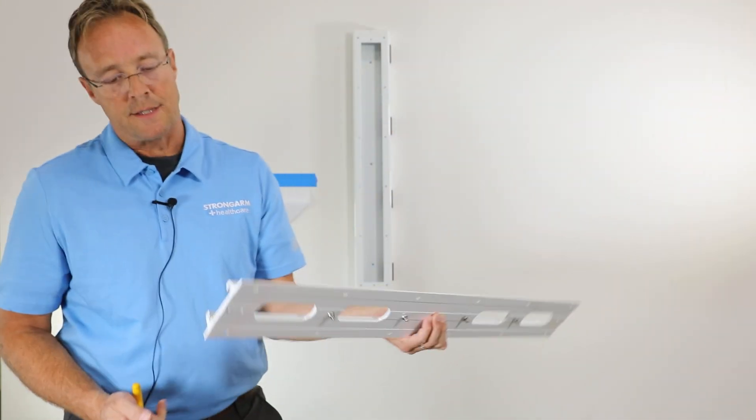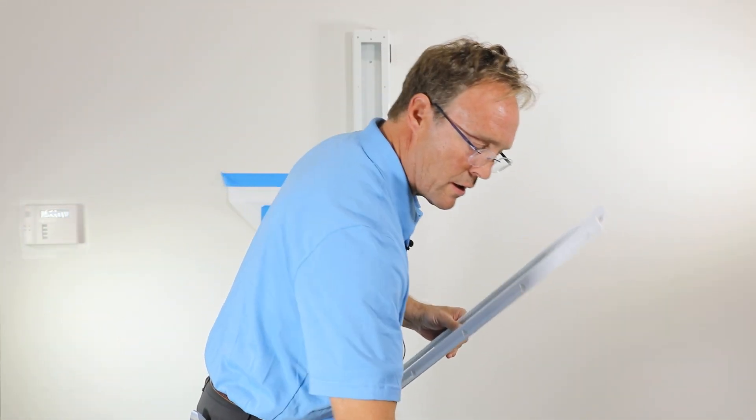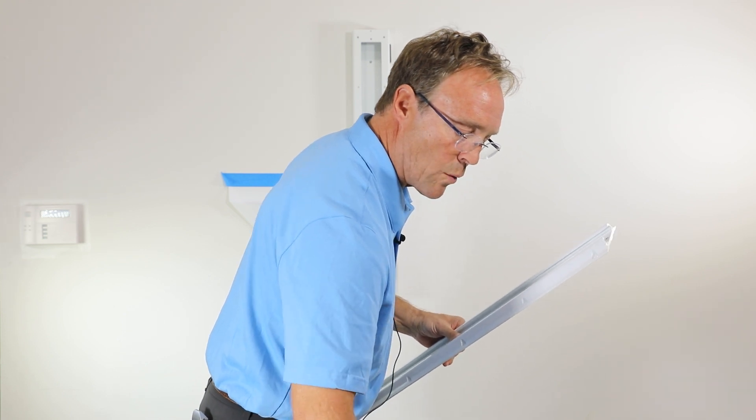And now we're putting on the wall plate. Again, I want to start the screw by hand because I don't want to cross thread.